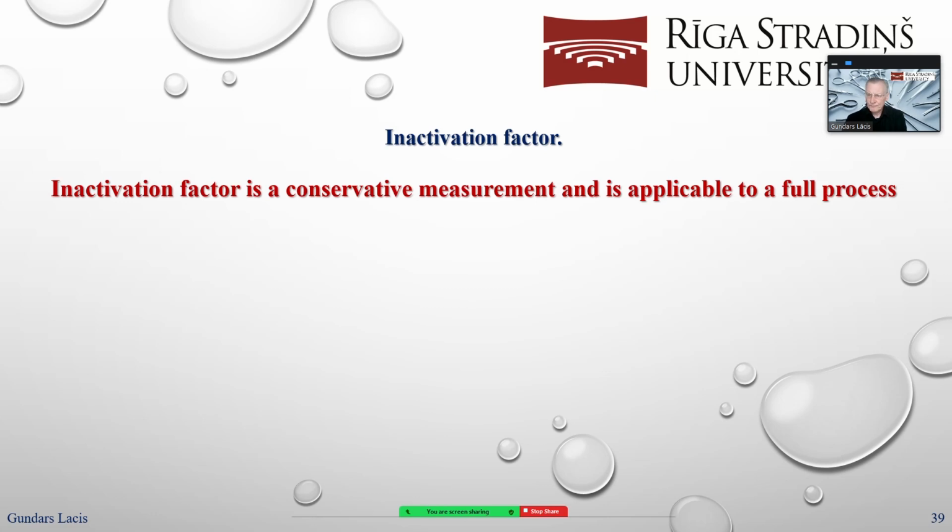Inactivation factor. Inactivation factor is a conservative measurement and is applicable only to the full process. Why is it conservative? Because all reductions are only given as a number of times. It's not a fixed value.